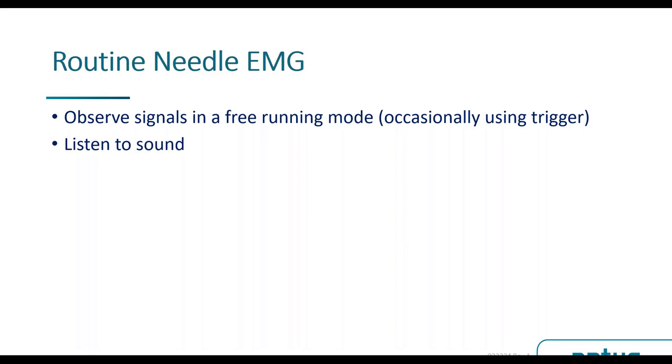The most difficult part about routine needle EMG examination is that it is subjective. It depends upon your training, how many hours you have spent observing the signals, the difficulty of patients, the kind of cases that you see. And it requires a certain amount of expertise and training in order to get better and better at needle EMG.